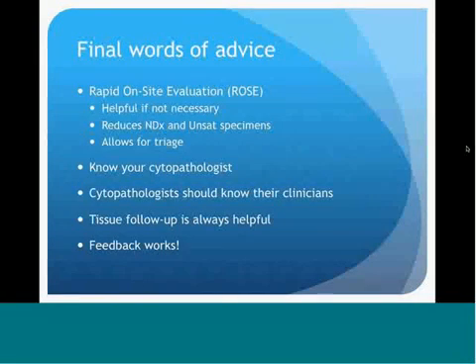So before we finish, I offer some final words of advice, just in closing. Rapid on-site evaluation of thyroid aspirates is very helpful in making preliminary diagnoses and also determining adequacy.